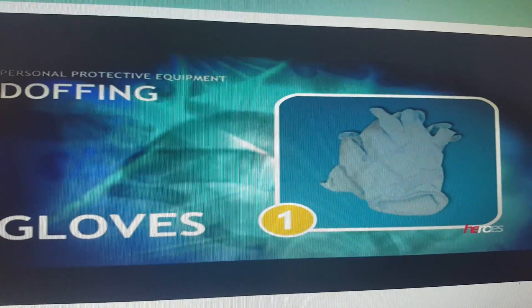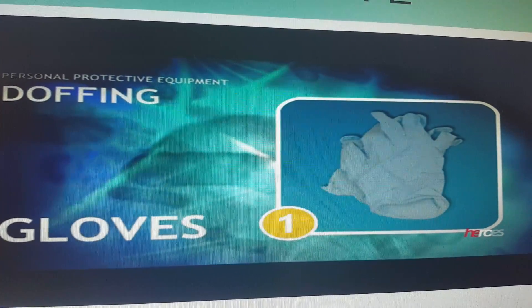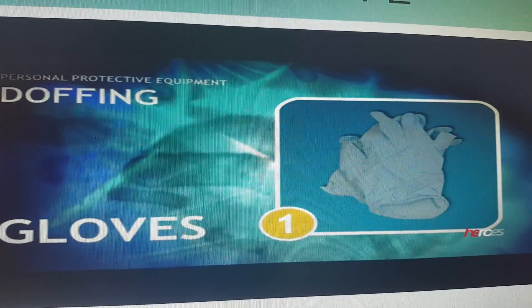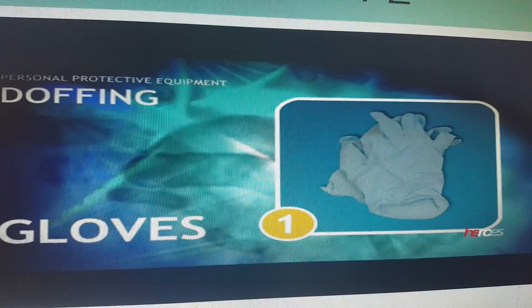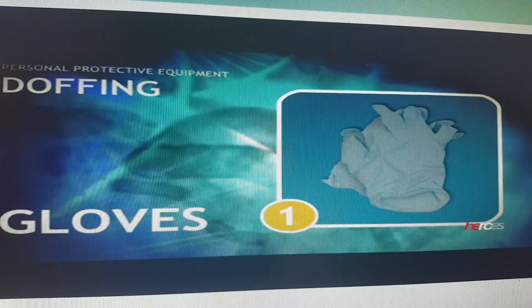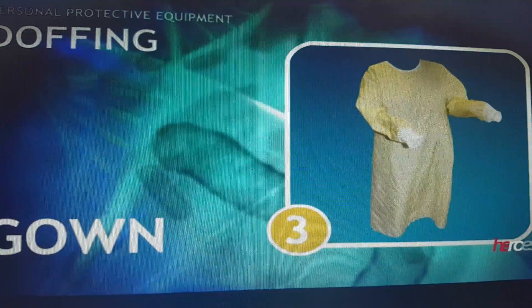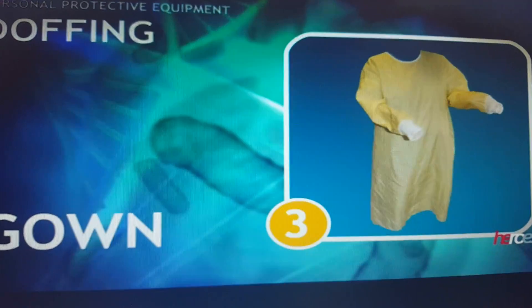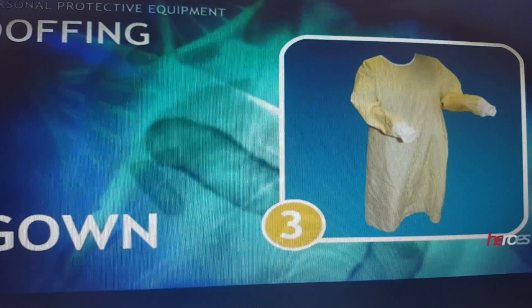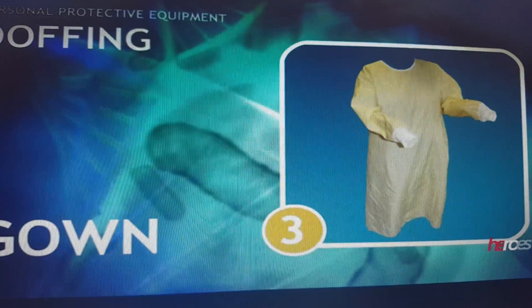How to remove the PPE: the gloves are the most contaminated, so you remove them first. Remove the first glove, then insert your finger inside the other glove from the inside to remove it. Do not touch the outside surfaces because they are dirty. Then remove the eye protection — the eye goggles. Then remove the gown, avoiding touching the outside surfaces; your hand goes from the inner side to the outer side. Discard in the yellow waste bin.